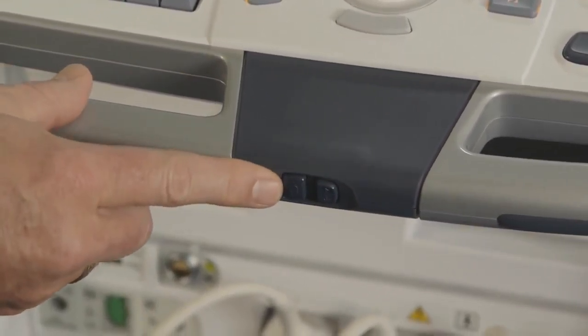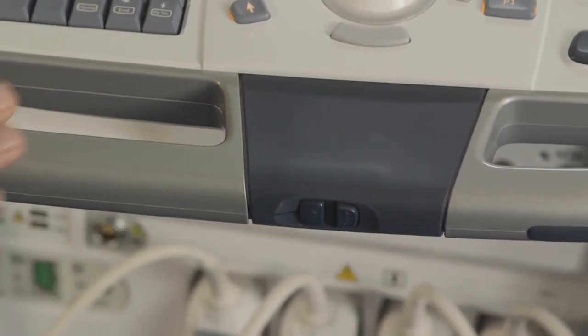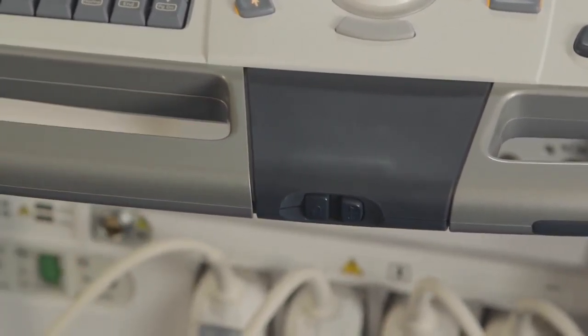This will display a new menu on the monitor. Use the trackball and set keys to select the device that you wish to eject properly. A message will display when it's okay to eject the device.